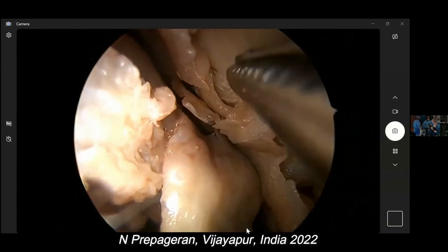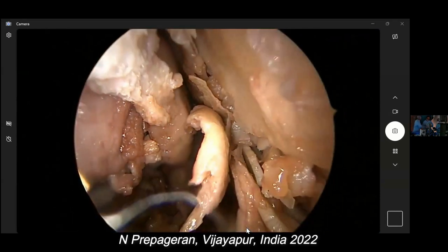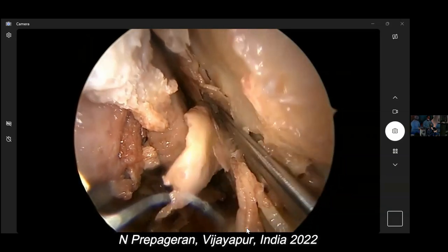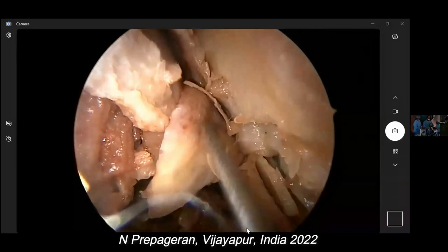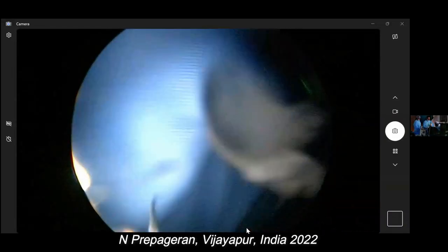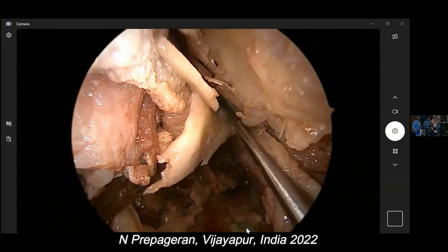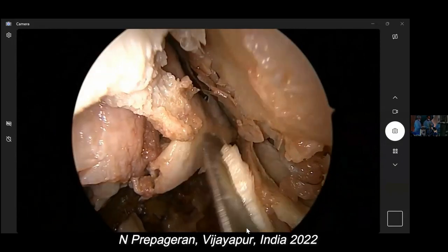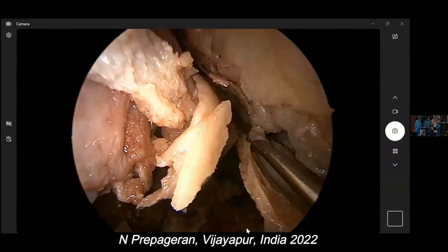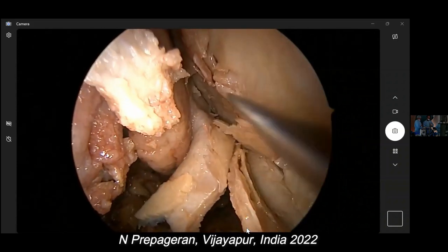Can you see? Because we have a Freer elevator. Yes, sir. So usually in real life, the mucoperichondral flap is very easy to elevate. In a cadaver, it's very difficult because the flap tends to be very thin. And I think they've also done some amount of septoplasty. So it's a bit difficult to raise the flap because septoplasty has been done as well. Okay, so all I want to do is to be able to identify the keel.